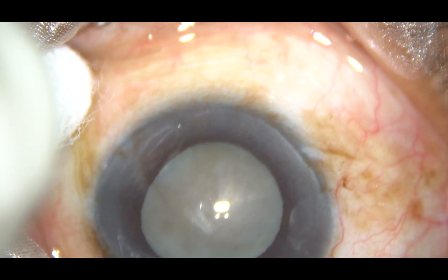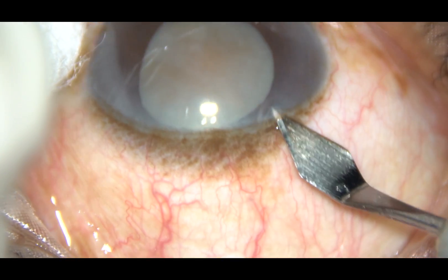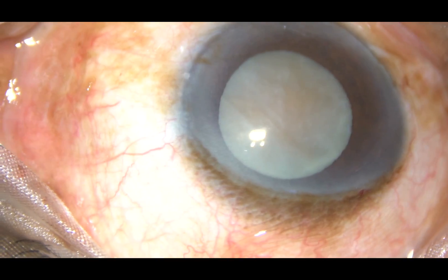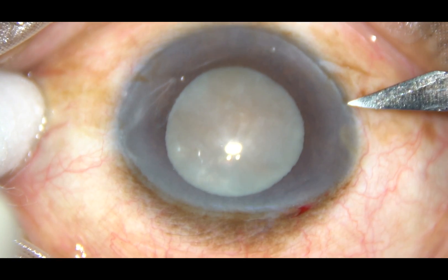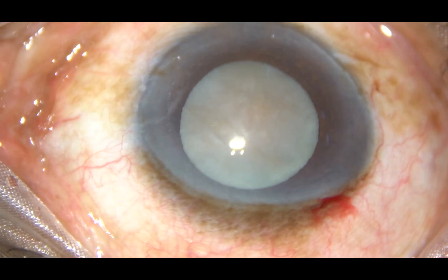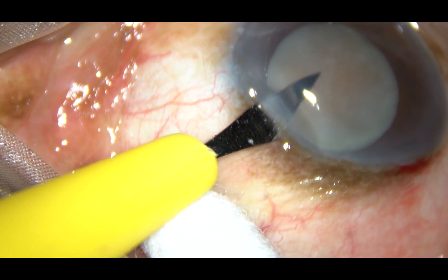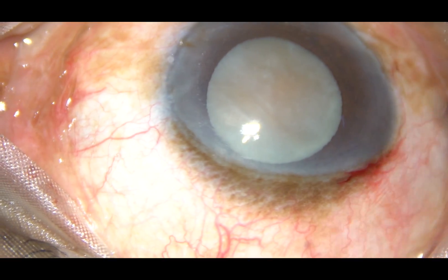This is a white hypermature sclerotic cataract. In this case, the epinucleus has degenerated into a white homogeneous curd-like material. We will see that later. There is no milky fluid, and these cases can be called hypermature sclerotic cataract. I have taken up this case for surgery.